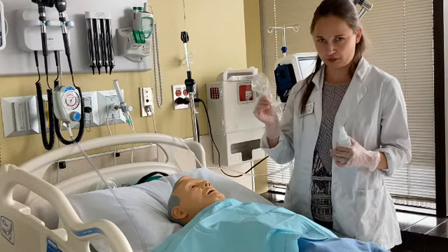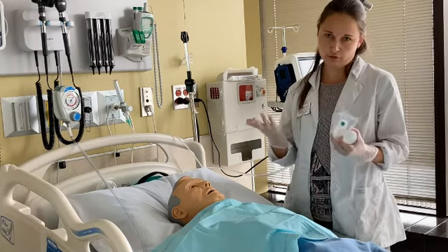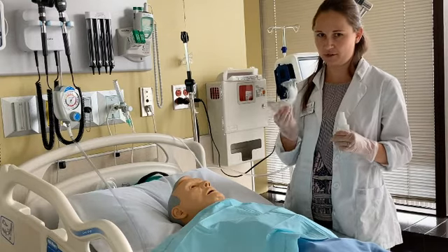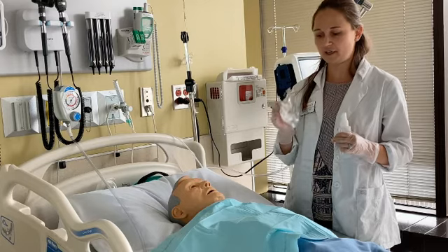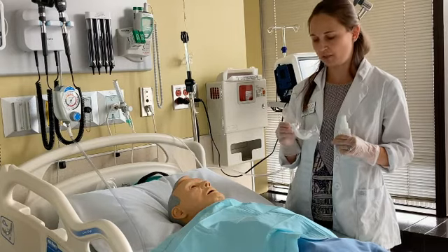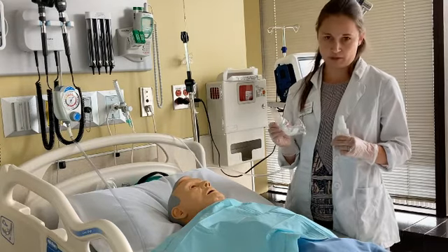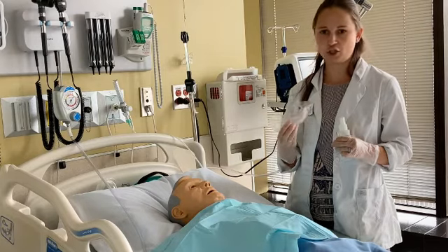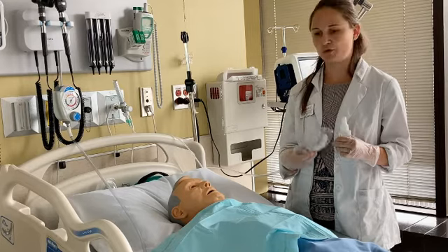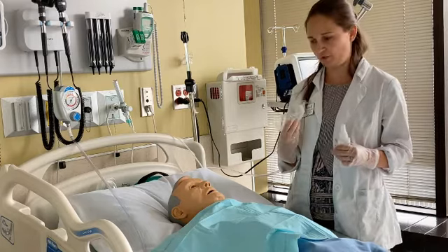So the oropharyngeal airway, it's a rigid airway and it is inserted into the mouth instead of the nose. And the difference between this airway and the nasopharyngeal airway is that it's actually quite a bit larger. It's hard, it's plastic. It prevents the displacement of the tongue in the mouth. But it elicits a gag response in a patient. So a patient who is conscious should not receive this airway because it may actually cause them to gag or to vomit and even change their cardiovascular status. So that is not a good choice for those patients.